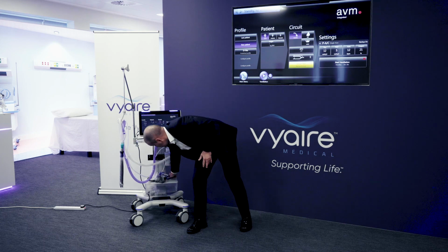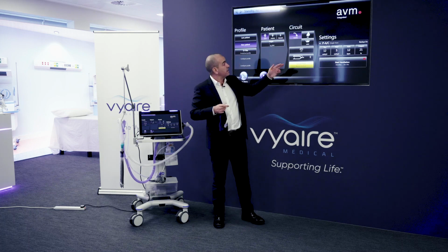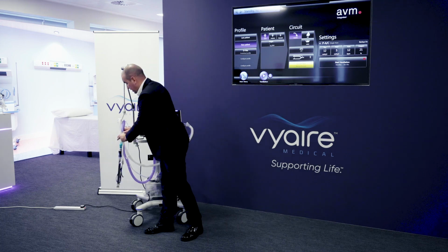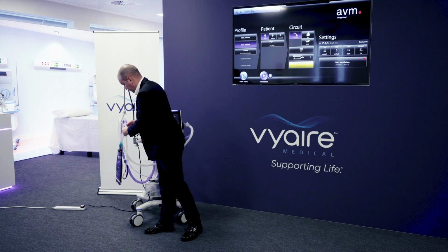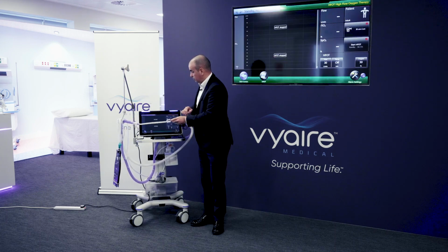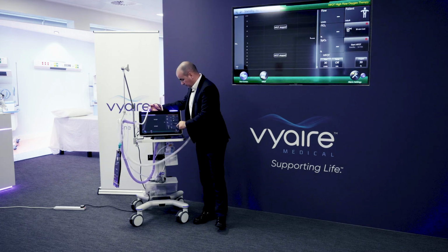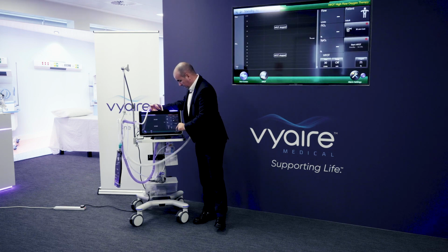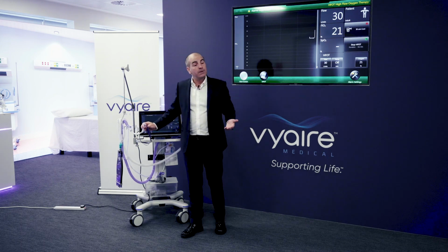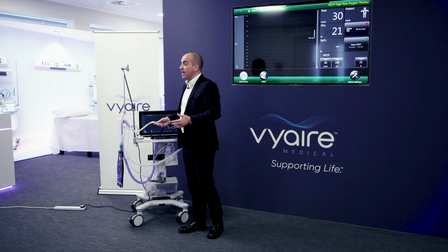Similarly, if the patient wants to maybe have something to drink, something to eat, they might want to, again, de-escalate and switch to high flow oxygen therapy. So all you would do is simply take the inspiratory limb, plug that in there, get a nice green screen, it's indicative that you're in high flow oxygen therapy. Just pop the flow down and start. So nobody's having to run around the department looking for a different piece of equipment, different circuits, different flow sensors, etc. It's all in one device.